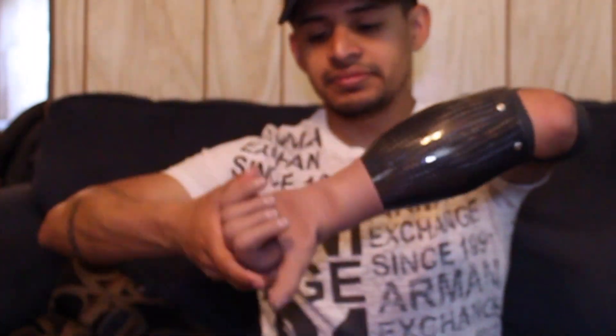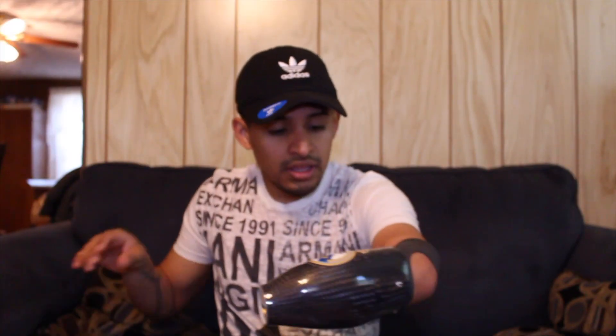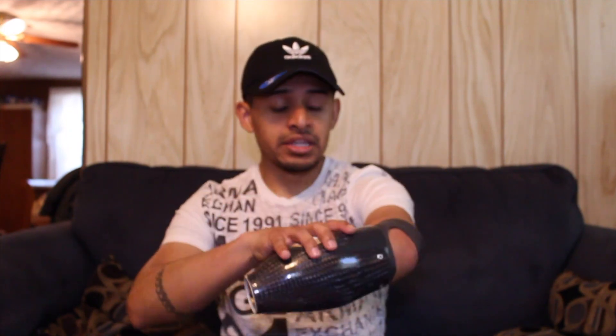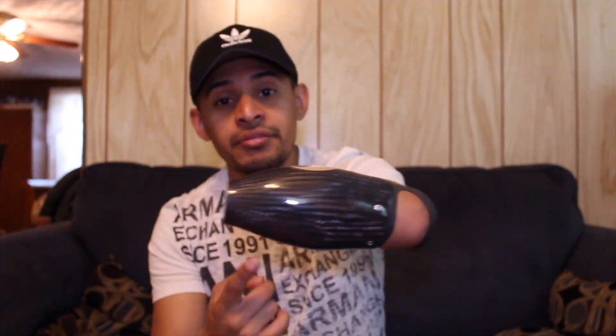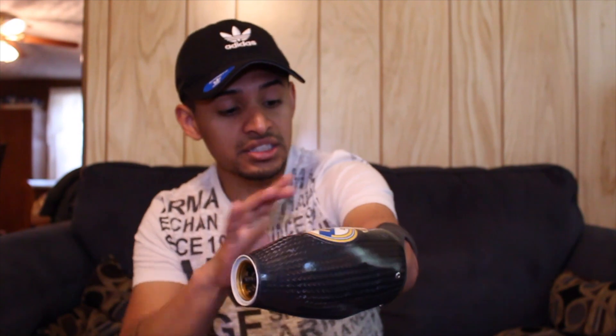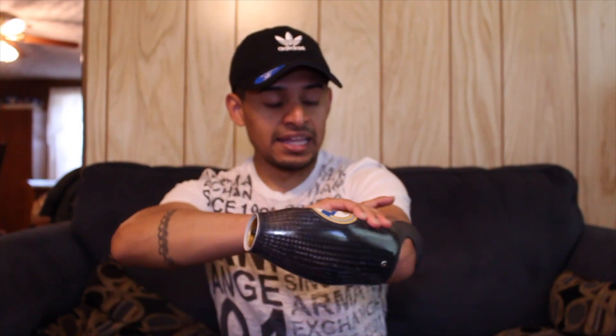They gave this to me — not for free exactly, but it came from what happened with my accident before. So let me tell you about the forearm first. You know how expensive it is — just this part here.